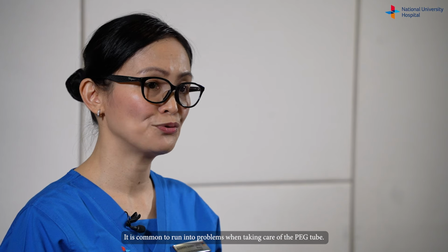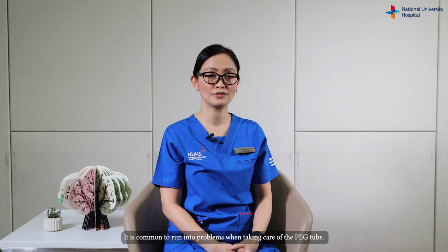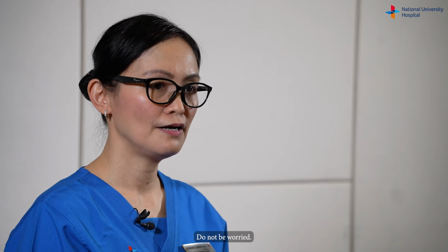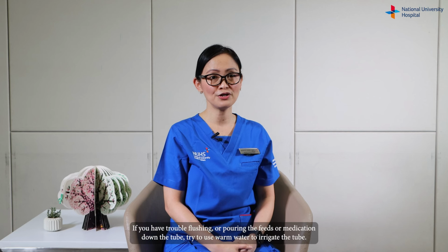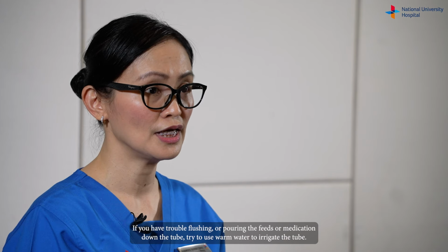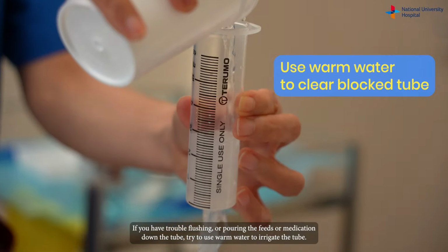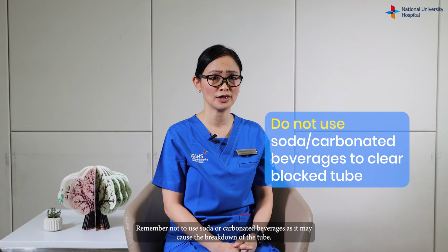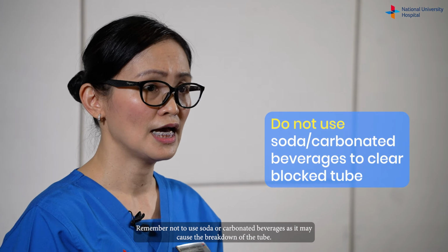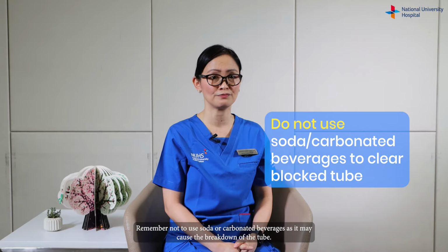It is common to run into problems when you're taking care of the PEG tube. Do not be worried. A problem that you may encounter is a blockage of the tube. If you have trouble flushing or pouring the feeds or medication down the tube, try to use warm water to irrigate the tube. Remember not to use soda or carbonated beverages as it may cause breakdown of the tube.